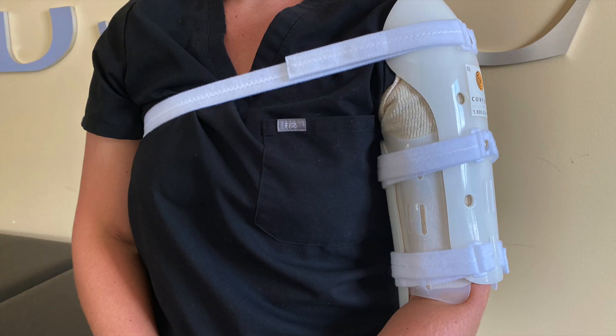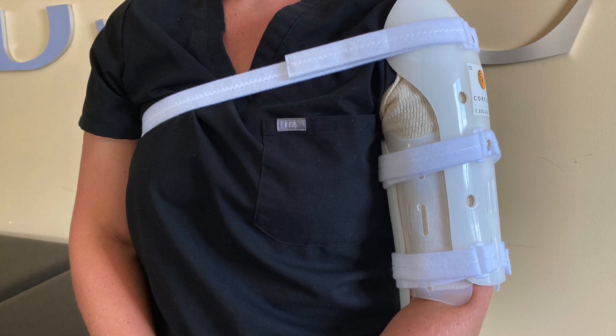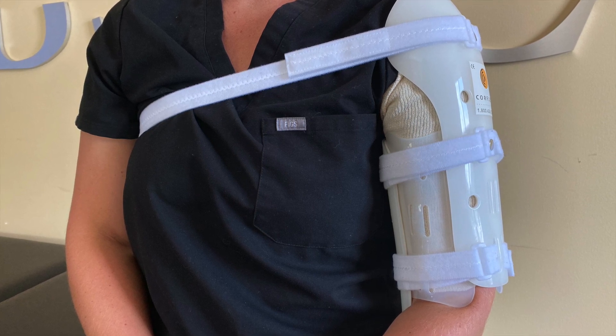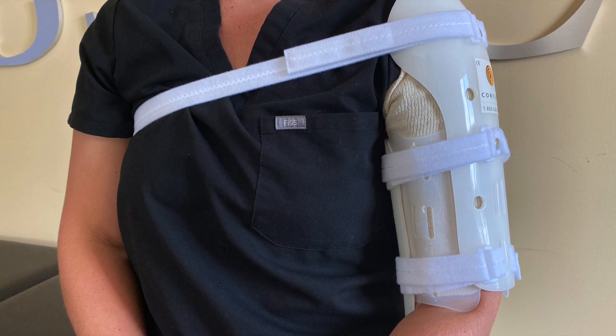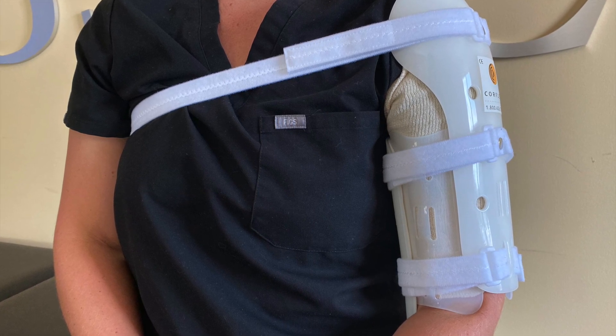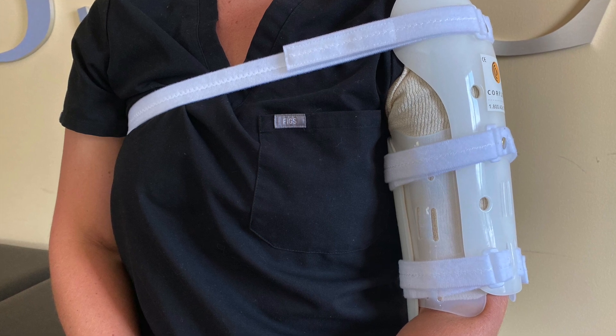Your provider may or may not also instruct you to remove your splint. The splint is intended to be worn as much as possible. Each time you remove the splint, the fracture may shift, disrupting the healing process and risking the bone healing out of alignment.